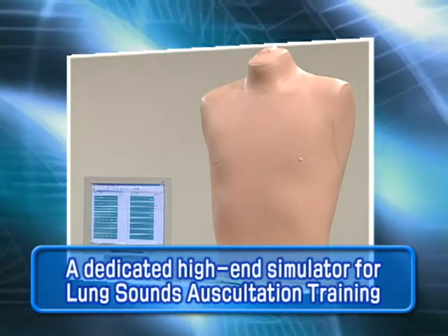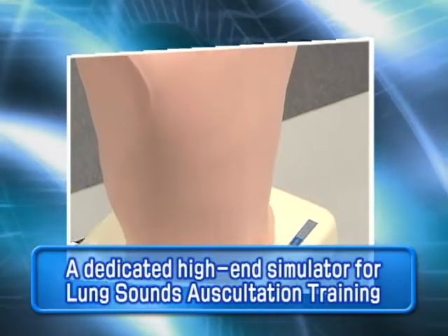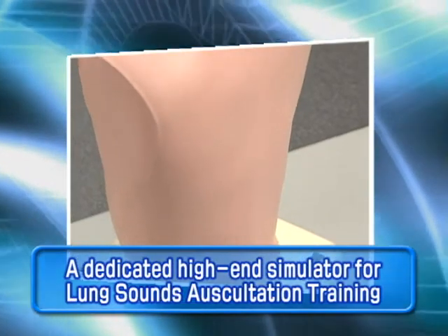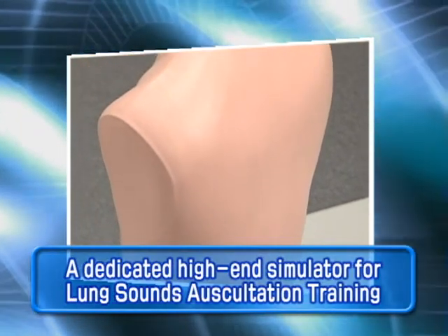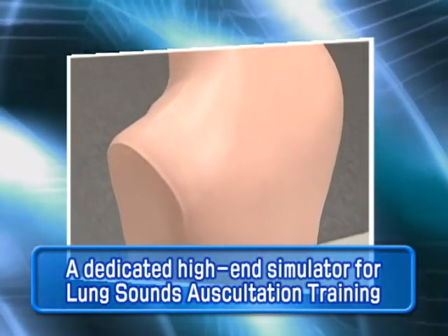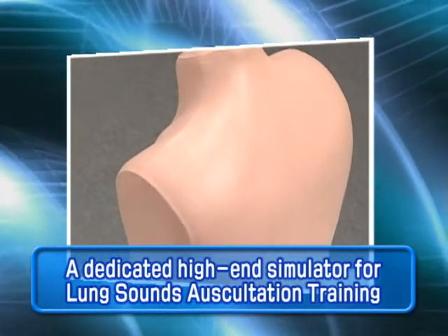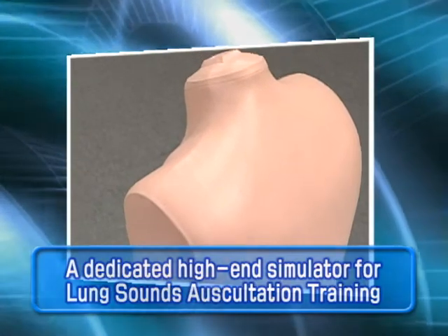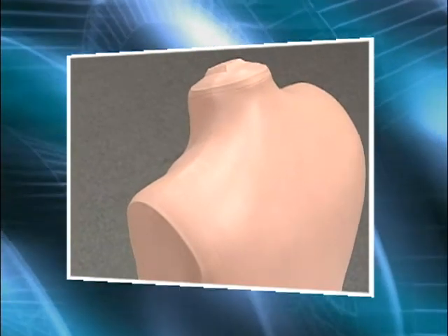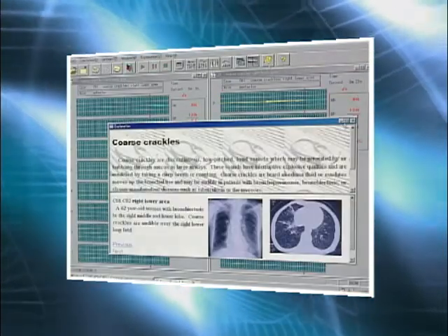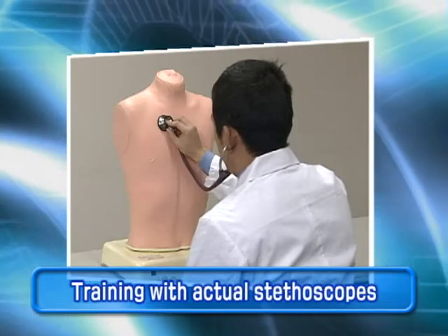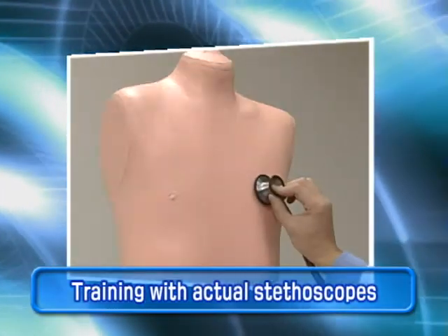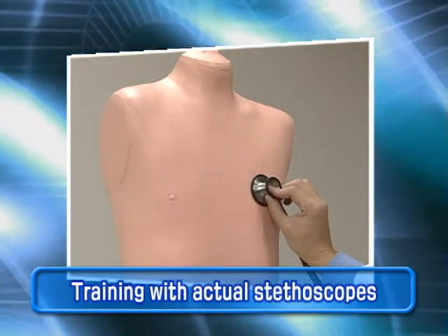The Lung Sound Auscultation Trainer, LSAT, is the world's first simulator developed for lung sound classification training. Natural lung sounds recorded from real patient cases can be heard with a normal stethoscope.